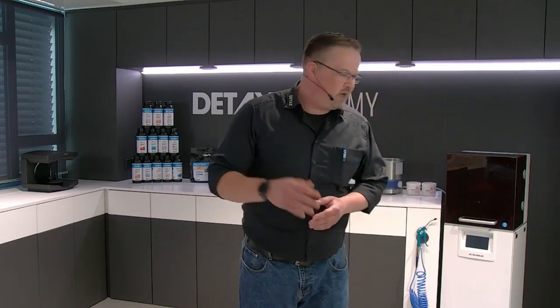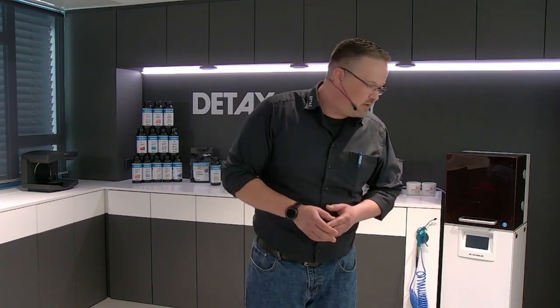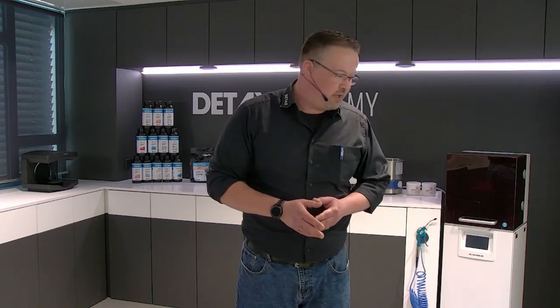Okay, how many parts can you print? We talked about it during the composer situation. How you can polish it is also one part here. Marcus showed us. It is really easy. How you can fix it, how you can permanently fix the crown later. We have two possibilities there. The Variolink Esthetic from Ivoclar is possible, and also the RelyX Unicem 2 from 3M ESPE. These are two possibilities we tested and validated. I'm sure we have a lot more, but please give us a bit of time for the validation processes.